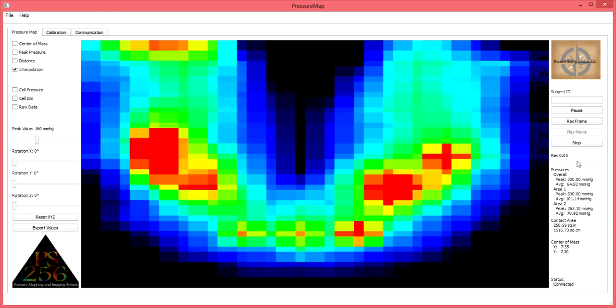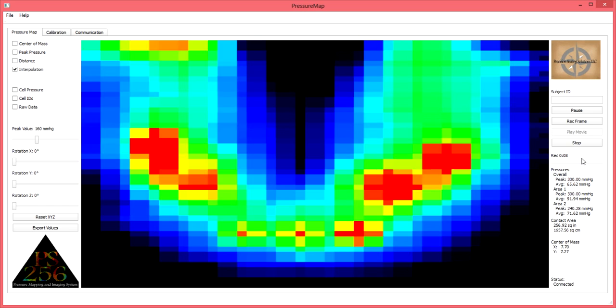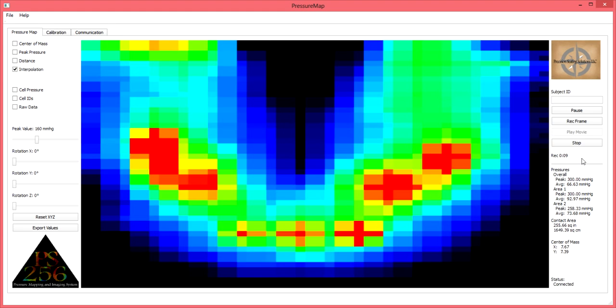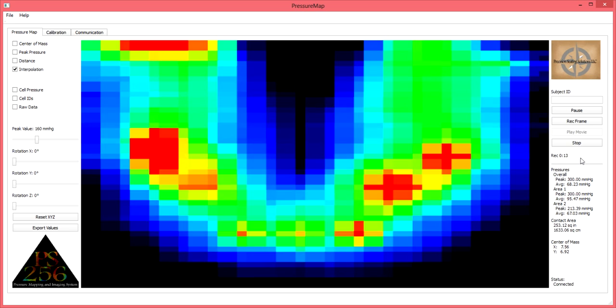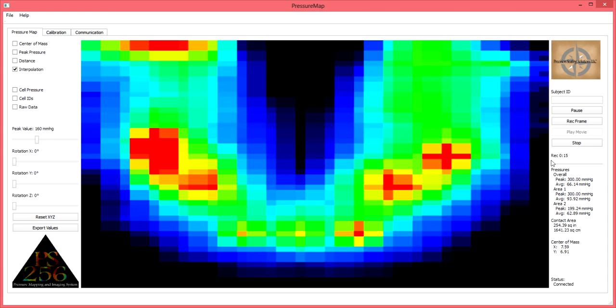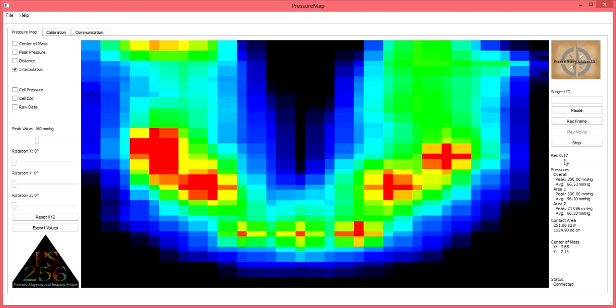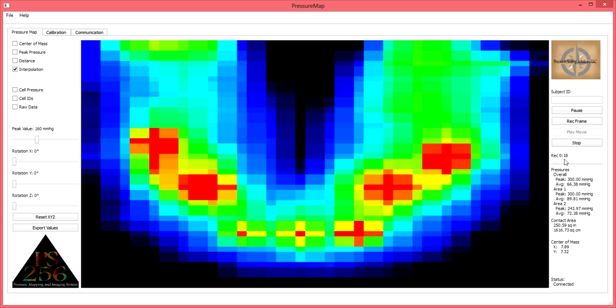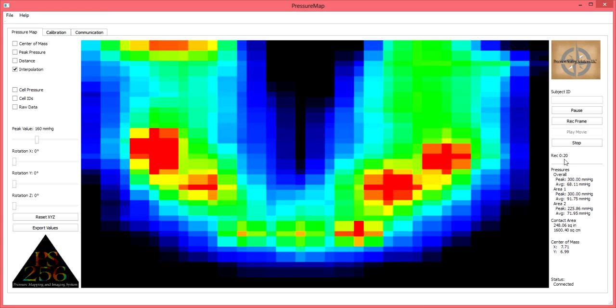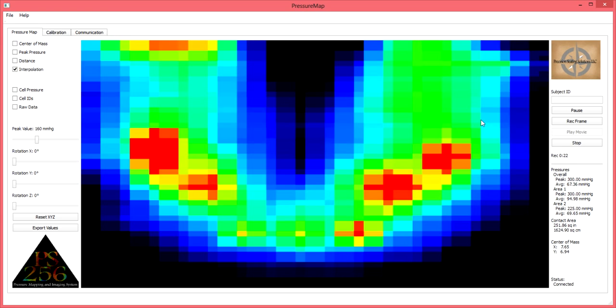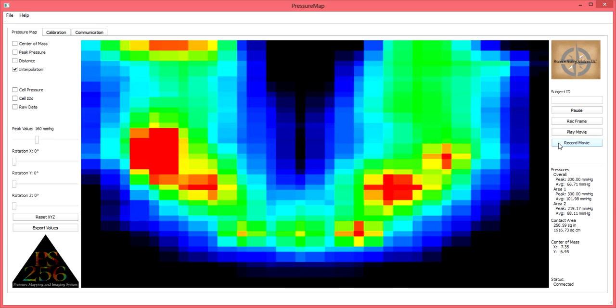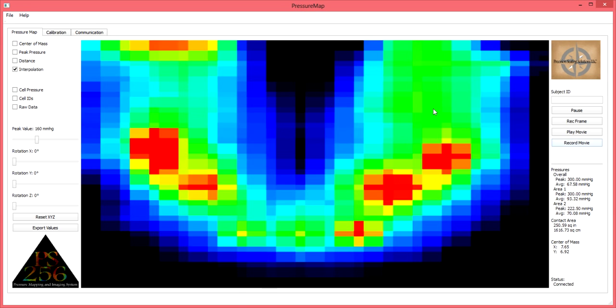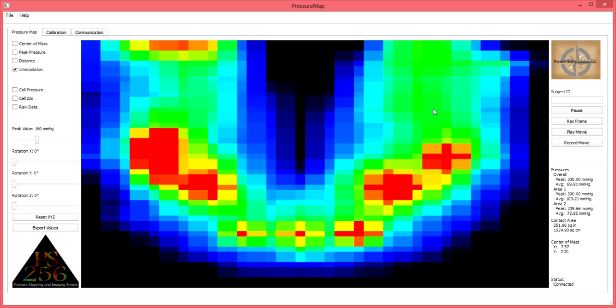On the right-hand side of the image, you'll notice that now the record movie button has changed to a stop button, and below the stop button, you will see a record timer. This is indicative of how long this recording is being taken, and when you're through recording, simply click the stop button, and that movie will be saved in your files.